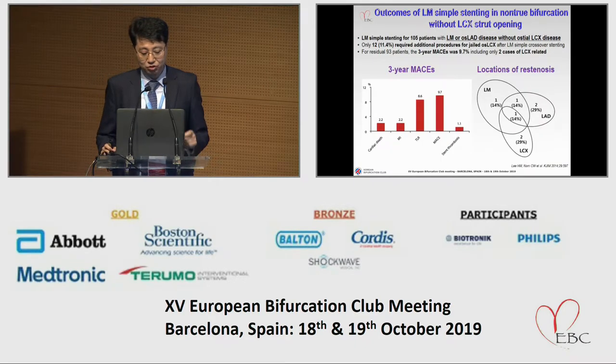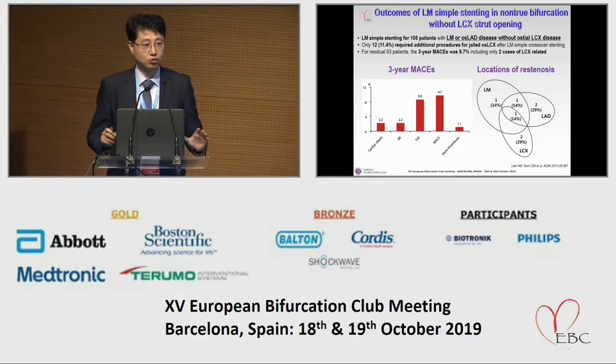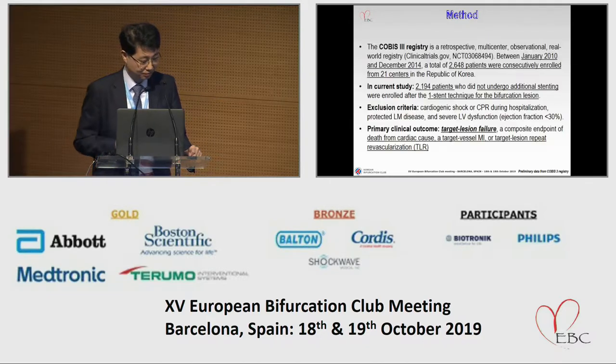Previously, I selected around 100 patients with non-true left main bifurcation who had a simple crossover technique without strut opening and followed them for 3 years. The clinical outcome was quite good, but it was a very small study and selected only non-true left main bifurcation. So this year, I'd like to answer last year's audience question. The aim of this study was to evaluate the long-term clinical outcome according to the side branch opening procedure of bifurcation lesions after one stent crossover technique from COBIS III V3.